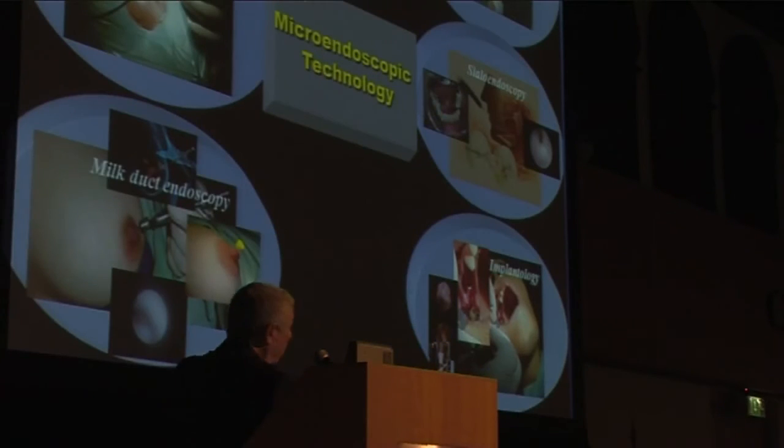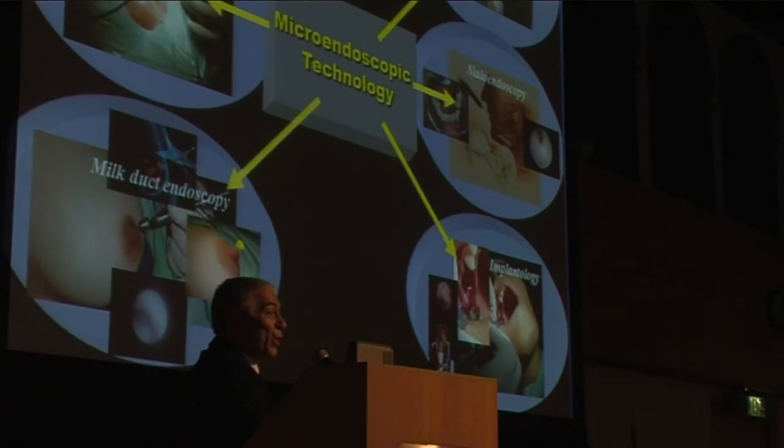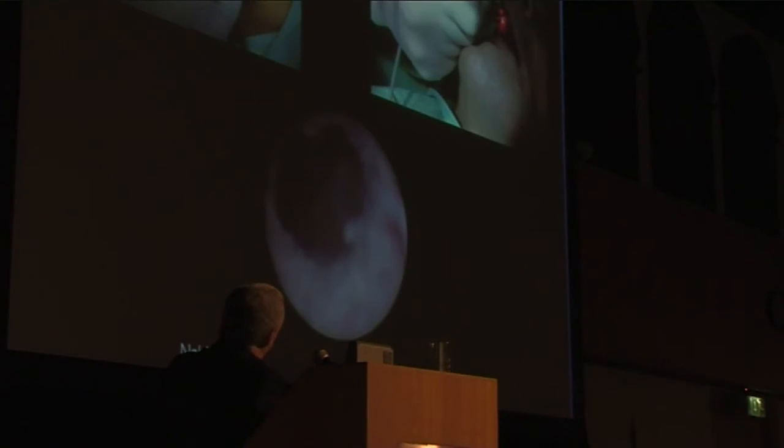And just to show you that we took this microendoscopy technique, and I will show you the connection between parotid and dental implants. So we can use the same technique, the same endoscope, for endoscopic sinus lift, as you can see here. Instead of removing stones with the mini forceps, we can insert bony substitute inside the sinus, as you can see here.